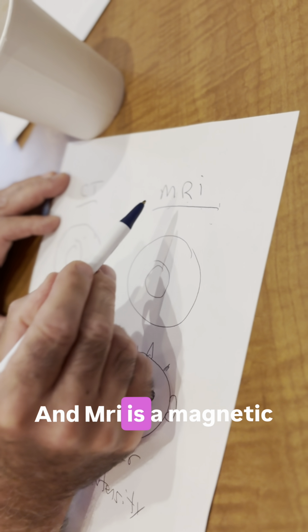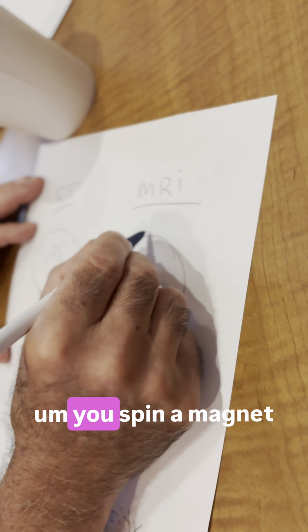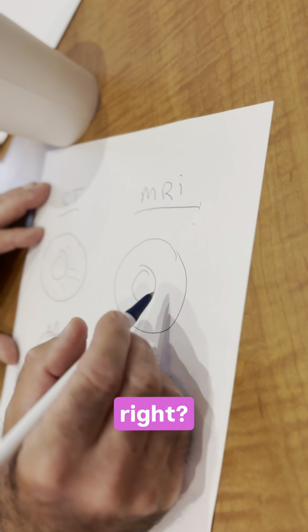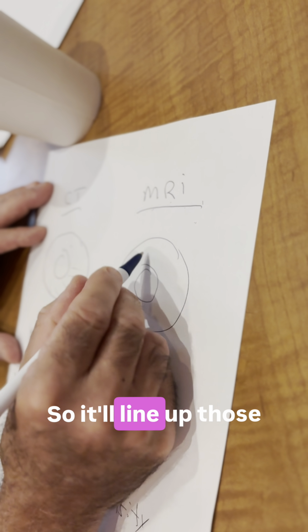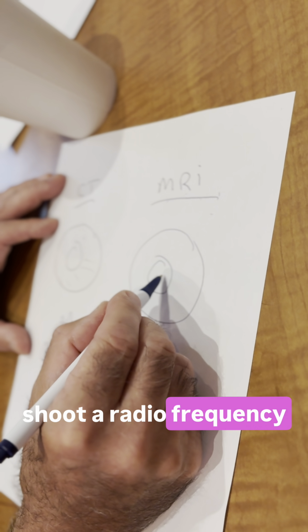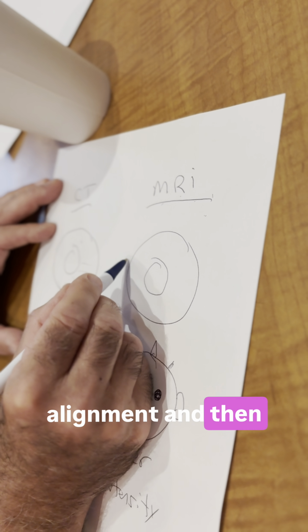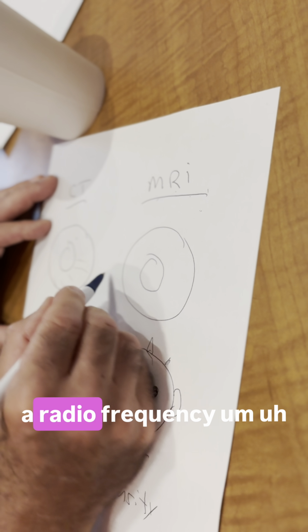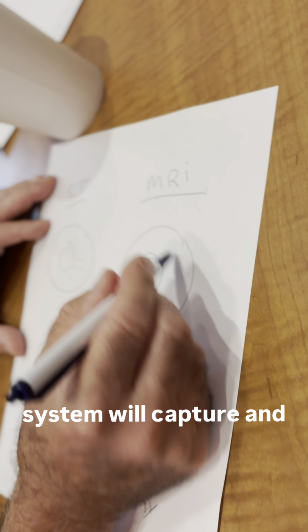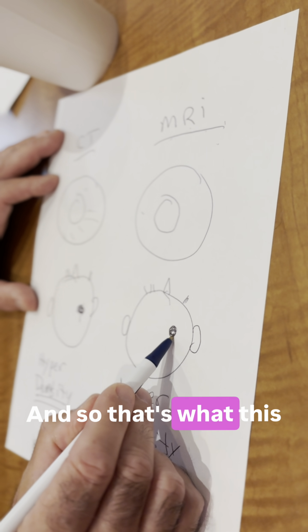An MRI is a magnetic resonance image, right? So what happens is you spin a magnet, and those magnetic waves act on the body, which is mostly made of water. Hydrogen is a proton, so it'll line up those protons, and then you'll shoot a radio frequency, which will knock some of those protons out of alignment. When they knock back into alignment, they'll emit a radio frequency emission, which the system will capture and then turn into a picture after a computer algorithm, right? And so that's what this is.